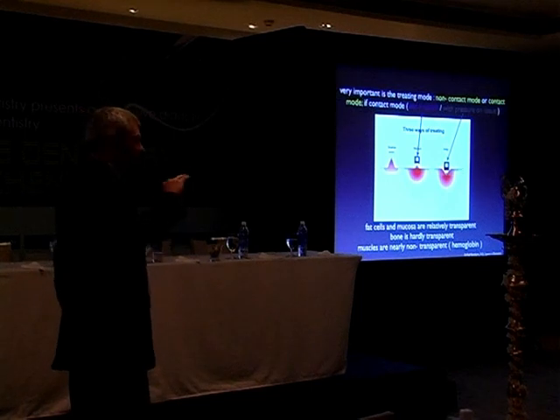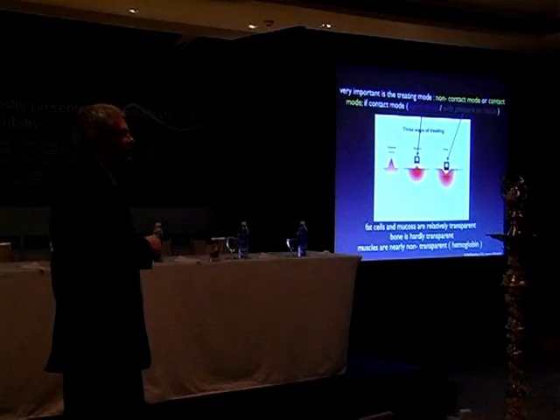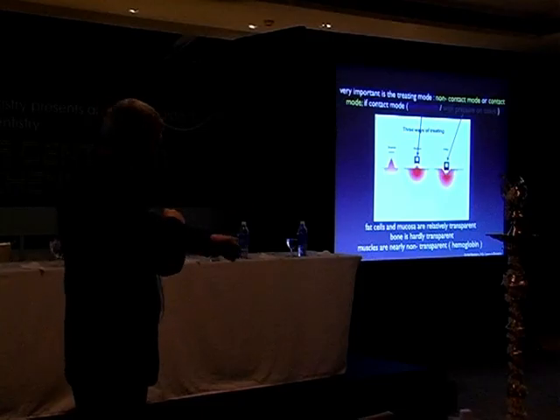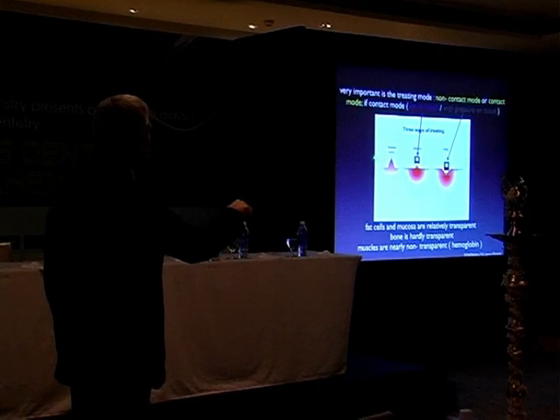If you want to reach an area just under the skin, you use it just on the skin. And if you want to reach a deeper area, a joint or something like that, you have to press it into the surface so you can reach deeper areas. With defocus mode, you will not reach deeper areas.